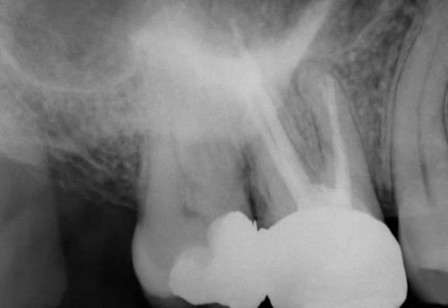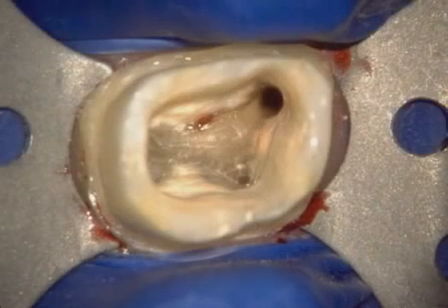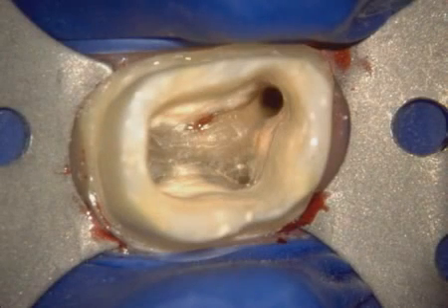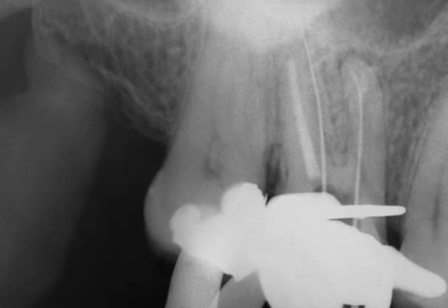Here's a case that was referred for surgical correction of an apical 1/3 perforation. However, maxillary first molars frequently have an MB2 system, and upon clinical isolation, we see the MB1 orifice and related groove. Small negotiating instruments are used to discover the true pathway to the radiographic terminus, and serially we move through the 10, the 15, and the 20 files.